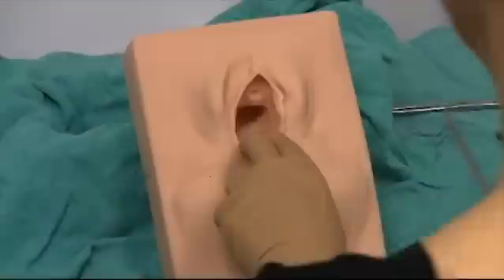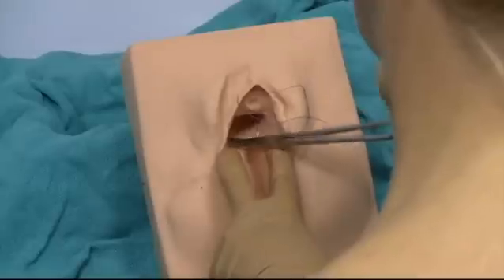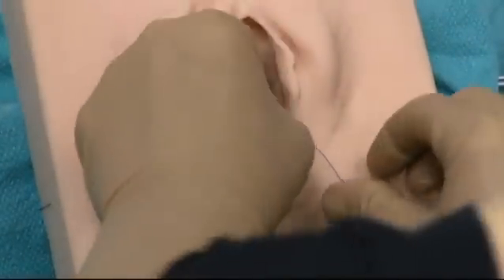In this video I'm going to show a slightly different way to repair the perineum. This is a second degree tear or an episiotomy midline. I think of the perineum as taking two pieces of triangle and bringing it together: the vaginal layer, the deep layer, and the perineal skin layer.